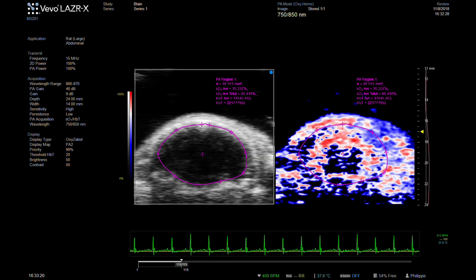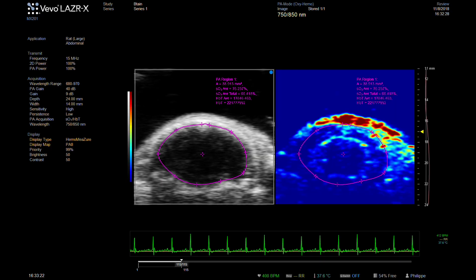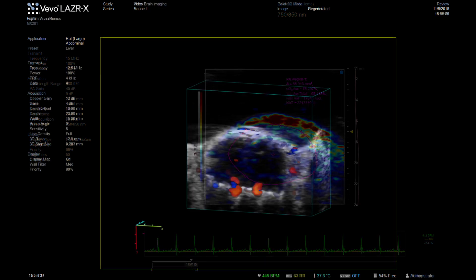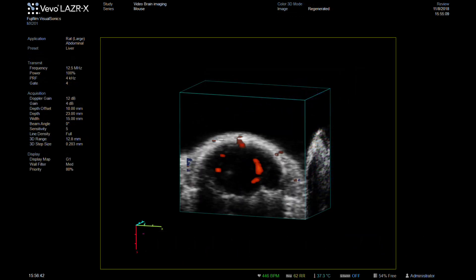In addition to the oxygen saturation, we can also measure the hemoglobin content. Here, the color parametric map shows the total hemoglobin content in the brain, allowing visualization of, for example, regions of hemorrhage.